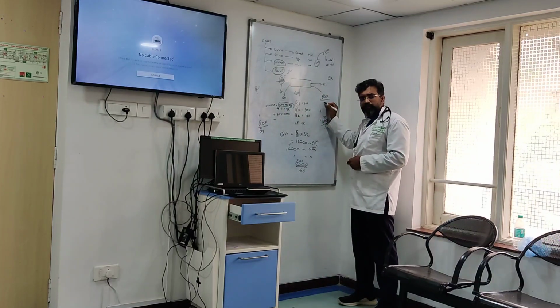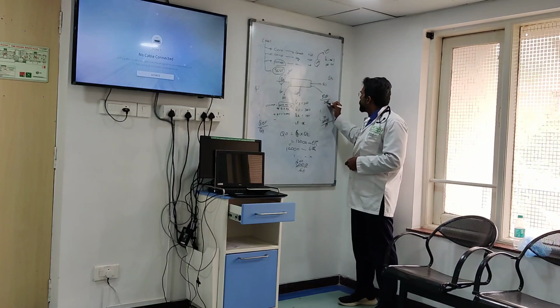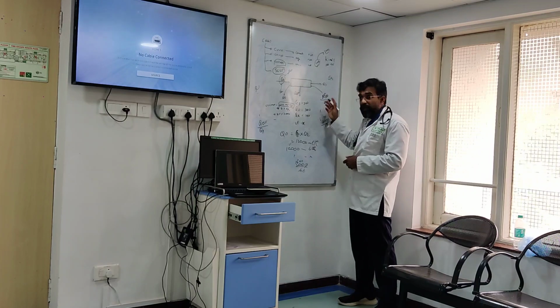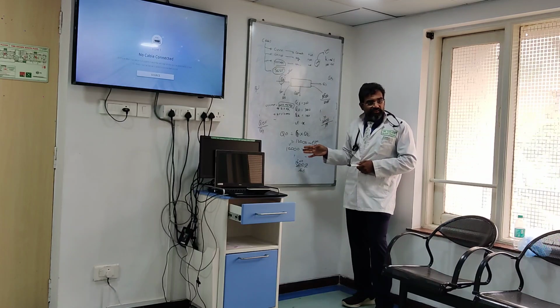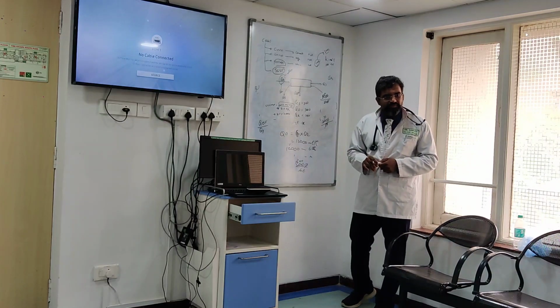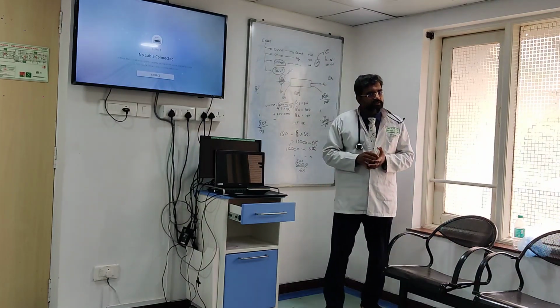Okay, कितना होगा ये? 200. 200 of 5,000. Okay, ये फिर भी ठीक लग रहा है. कितना लग रहा है? 25. So it's high, more than 25%. Are you understanding? I have a problem. You understand? Filtration, that's why it's a problem to do such high volume therapies.